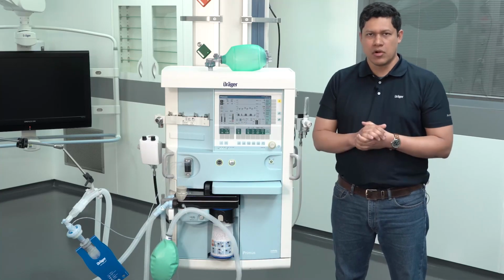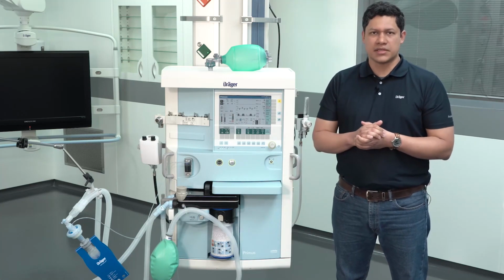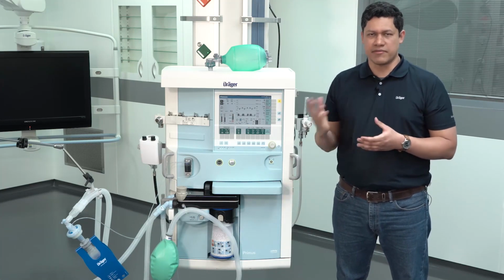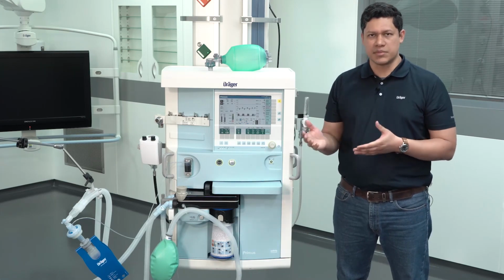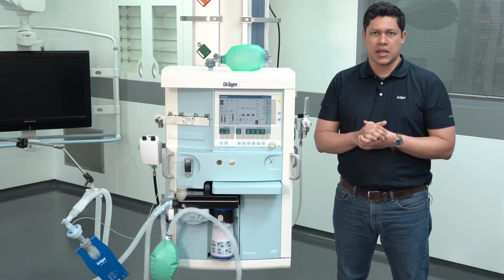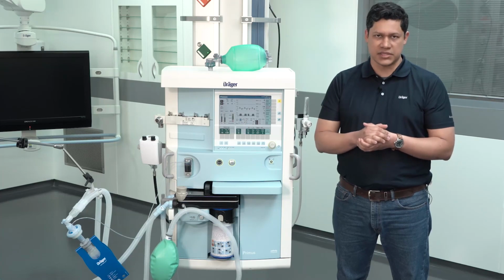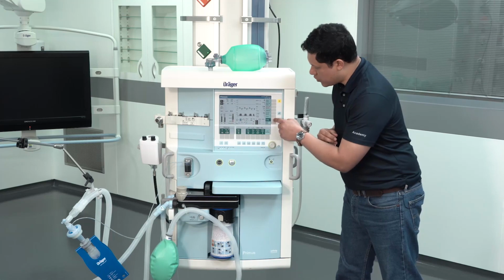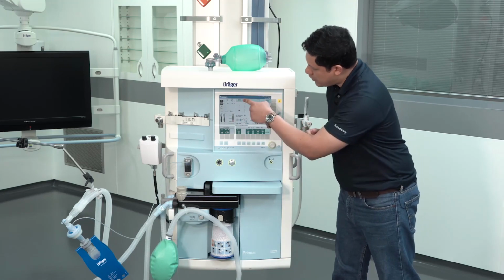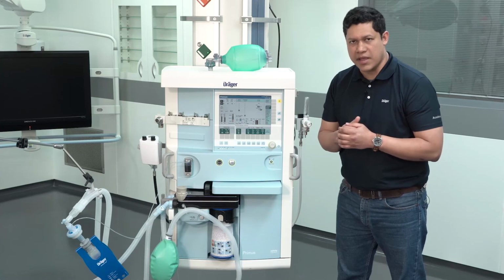If possible, always stay in the vicinity of the anesthesia device. Remember, the alarm management of the device has been designed so that the user is always in proximity of it. When this is not possible, keep in mind that the maximum alarm volume has to be set. To do so, go to the configuration button, confirm the alarm volume, and use the rotary knob to take it to the highest level.